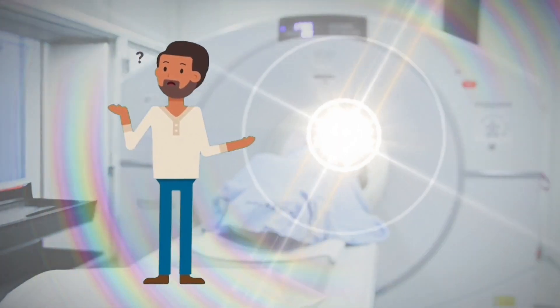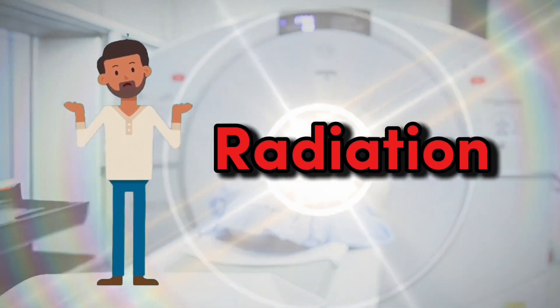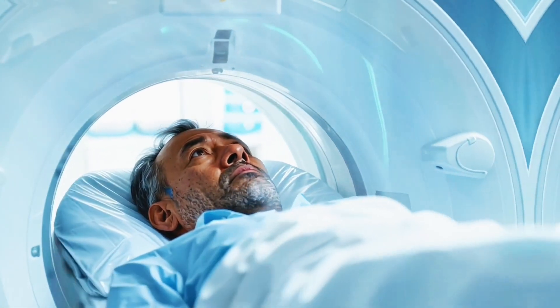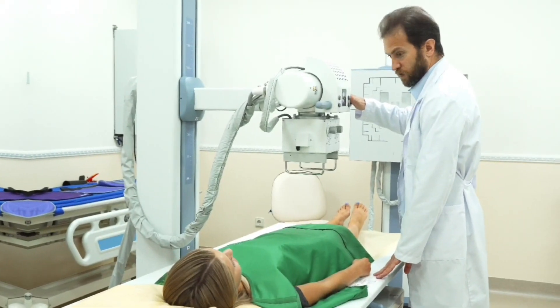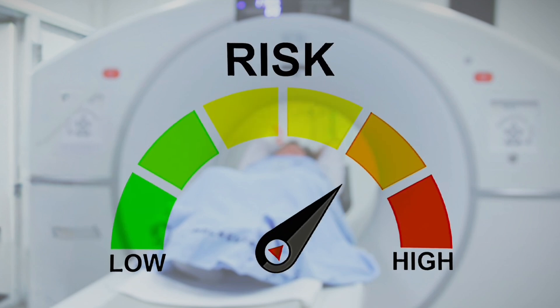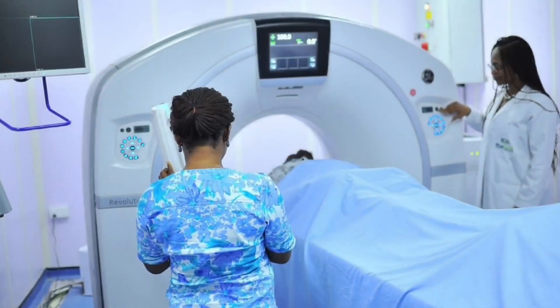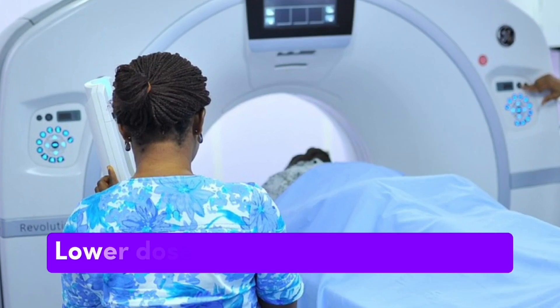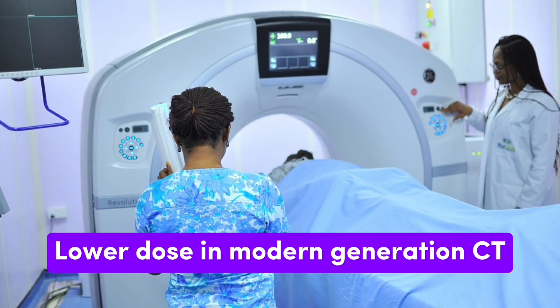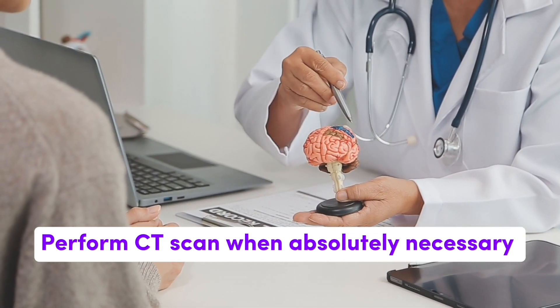Now, I know what you are thinking — what about radiation? It's true that CT scans do expose you to more radiation than a regular x-ray. But here is the thing: the benefits usually far outweigh the risks. Modern machines are designed to use the lowest possible dose, and doctors only recommend CT scans when they are absolutely necessary.